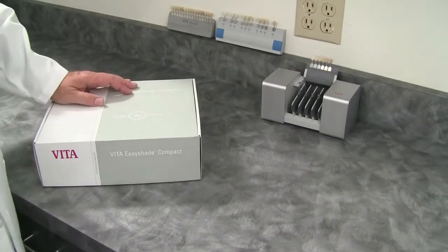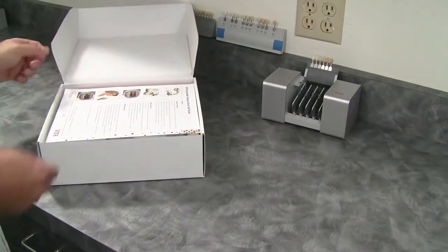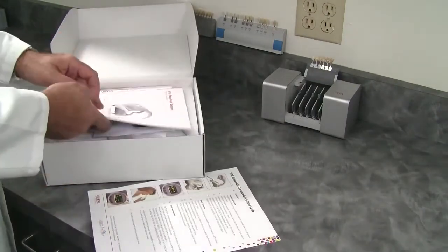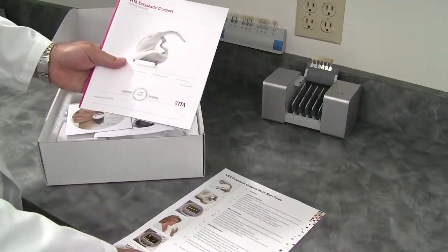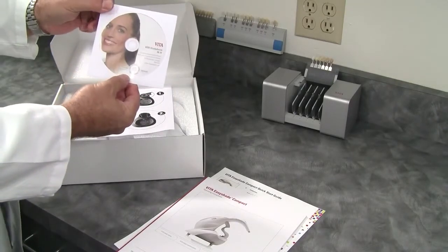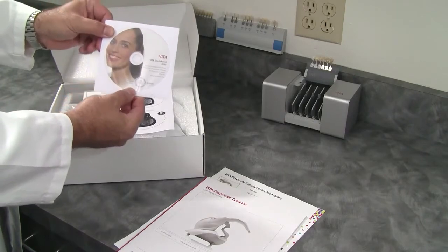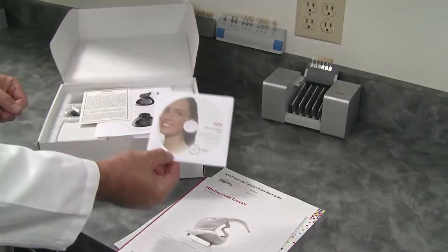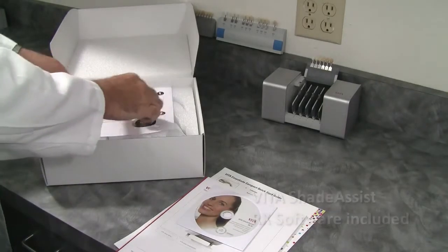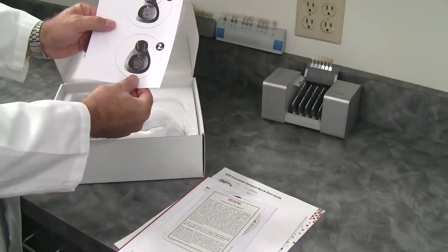I've just received my new EasyShade and I'm going to open the box and put it together. When you open it up, you're going to find the Vita EasyShade Quick Start Guide, the complete user manual, a CD which has software allowing you to export shade data to make a prescription form — prescription software called Shade Assist — and some comments on warranty.